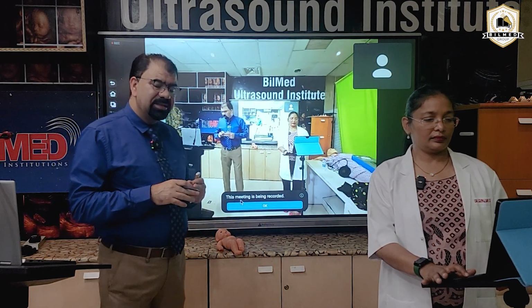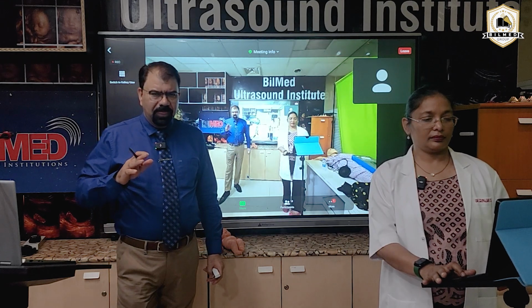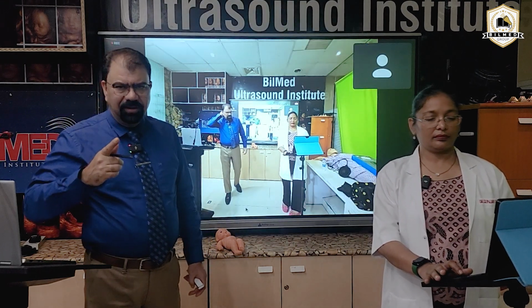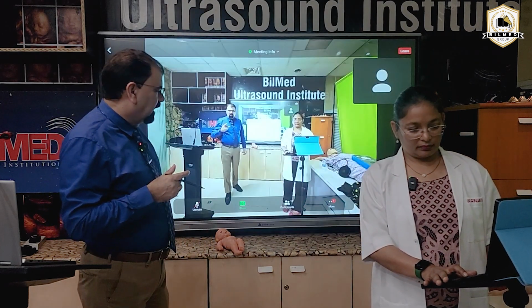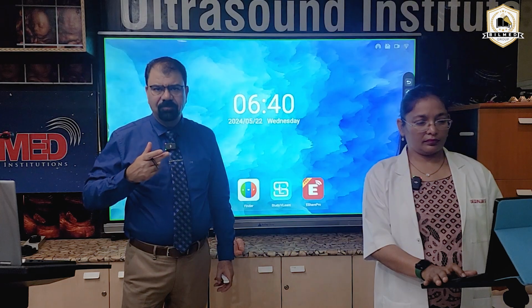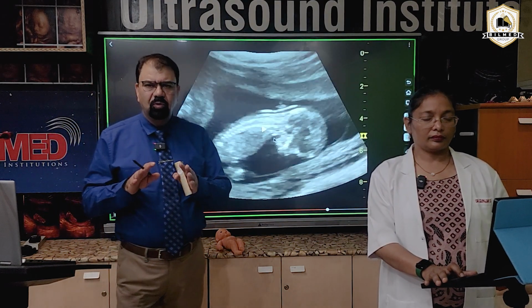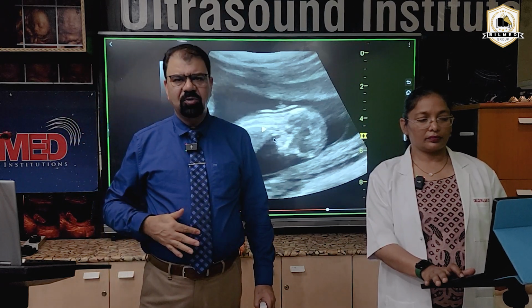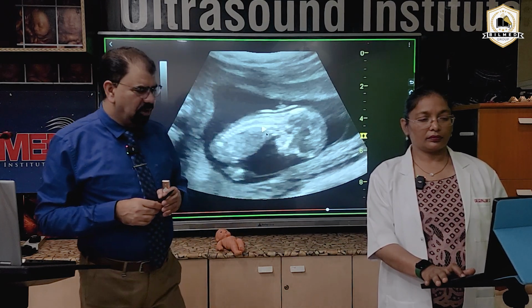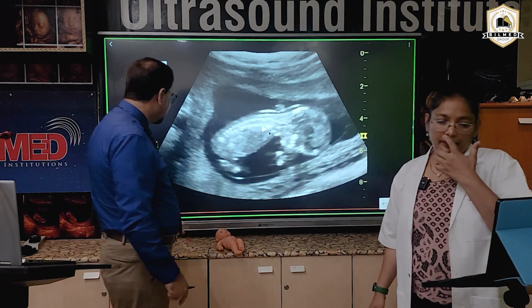Now, the point here is what to see for. First of all, the Nuchal Translucency. Second, you have to see for ductus venosus, DV. Third is the ICT, intracranial translucency, and sometimes we have to see for tricuspid regurgitation. But if you are able to see the nasal bone, nuchal translucency, and ductus venosus, that much is sufficient for a good NT scan.